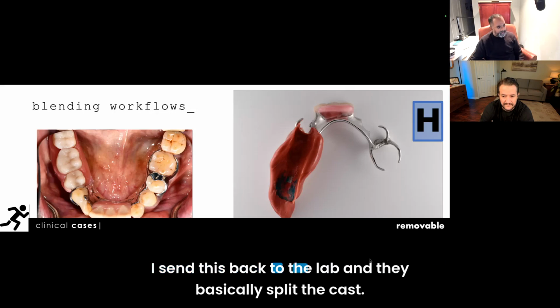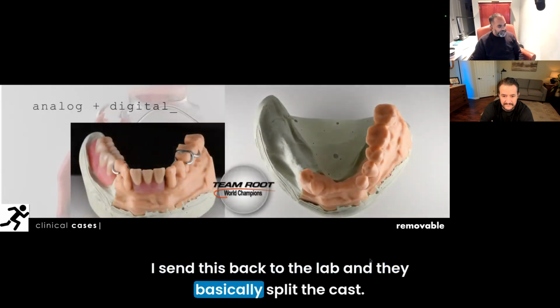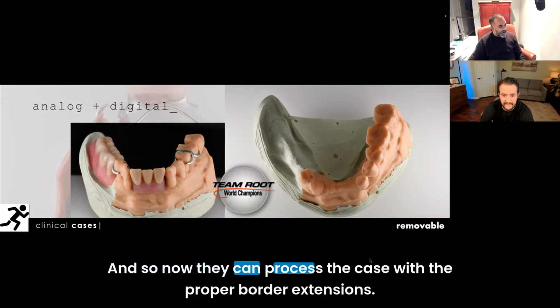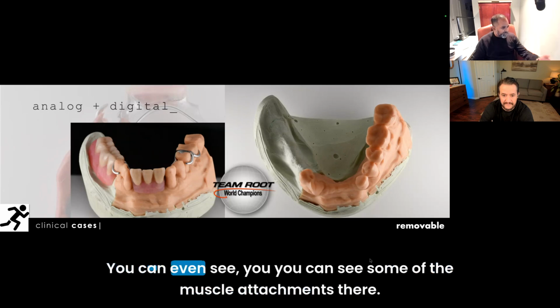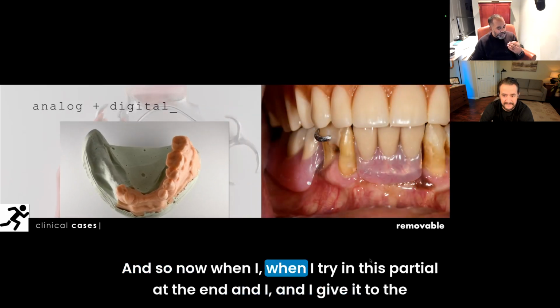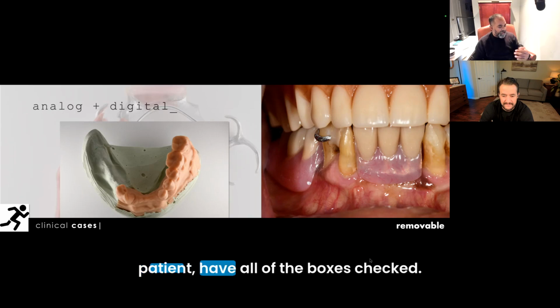I send this back to the lab, and they split the cast. This is literally a split cast, half printed, half stone. Now they can process the case with the proper border extensions. You can even see some of the muscle attachments there. So when I try in this partial at the end and give it to the patient, I have all of the boxes checked.